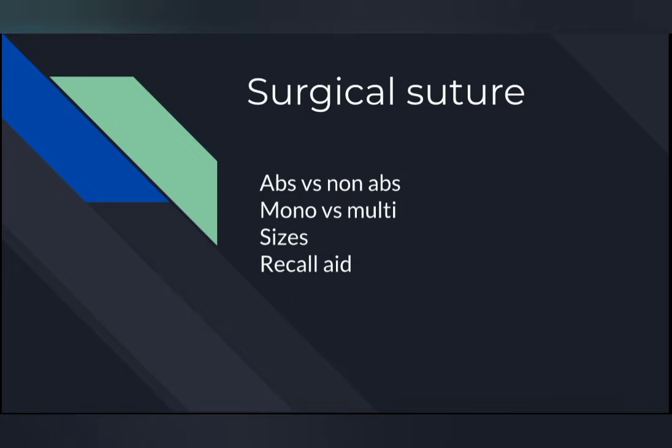But on the other hand, because multifilament is braided, you have all these pores and crevices that can cause bacteria to be lodged, and it can become contaminated quite quickly. So that is not something you would want, right? But then again, certain times you have to weigh the risks against the benefits, and then make your decisions, right?